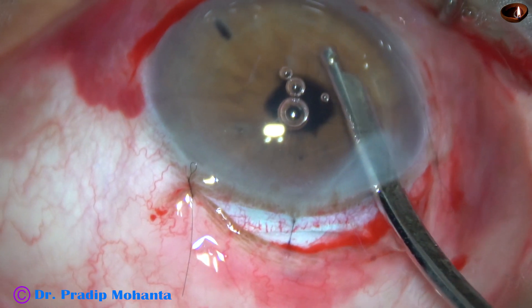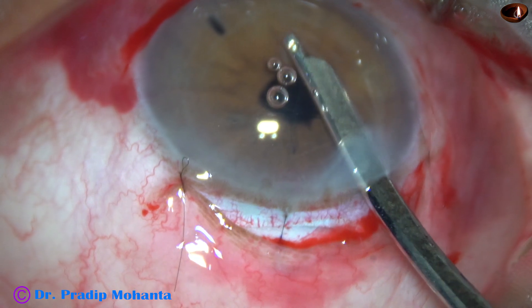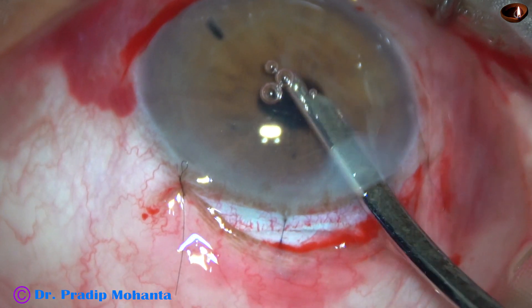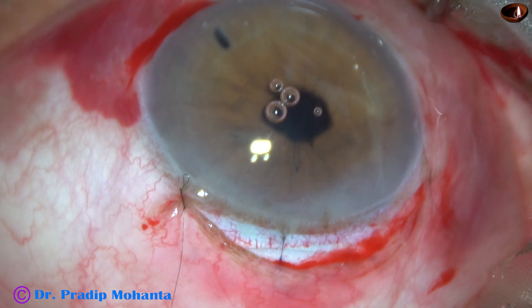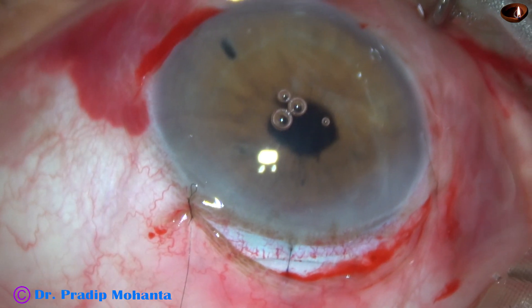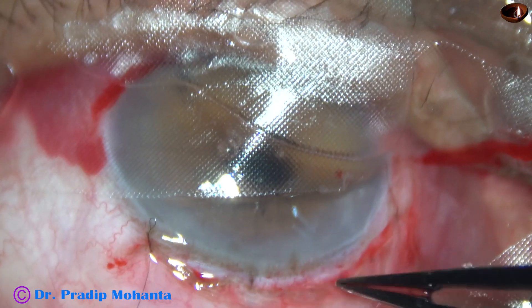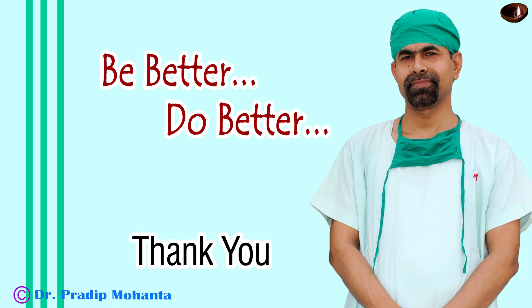And this is the final lavage of the anterior chamber. There is no vitreous disturbance. The anterior chamber is formed. And now the last step is injecting a bit of moxifloxacin. The anterior chamber is nicely formed. After removing the speculum, I advance the conjunctiva to the limbus and conclude the case. Thank you very much for your attention. Hope this video will help you in managing such cases.